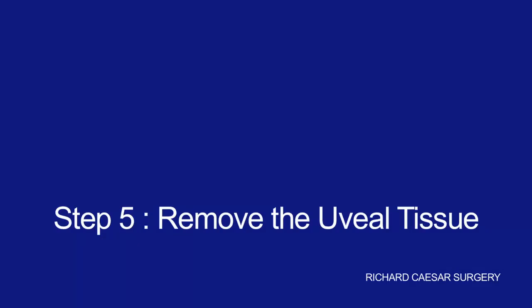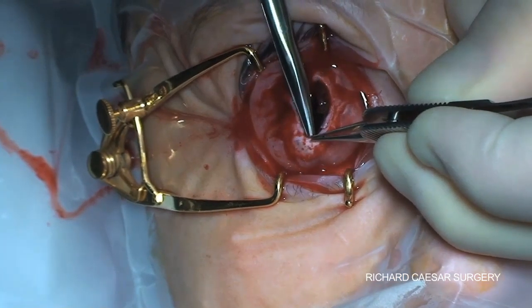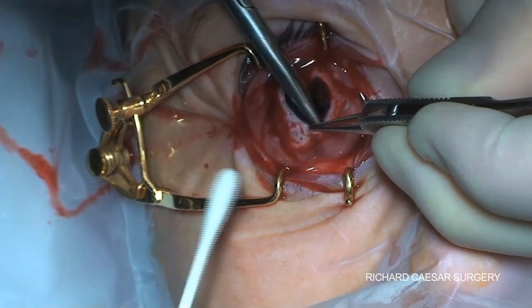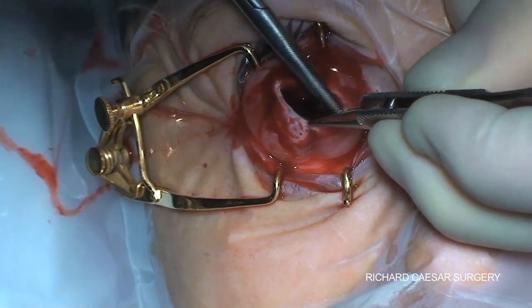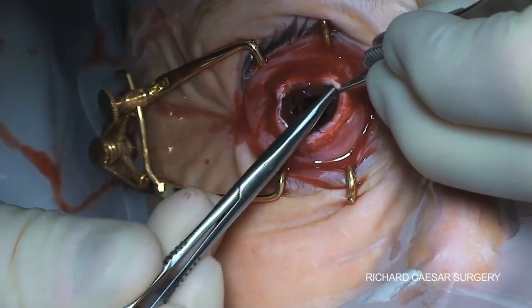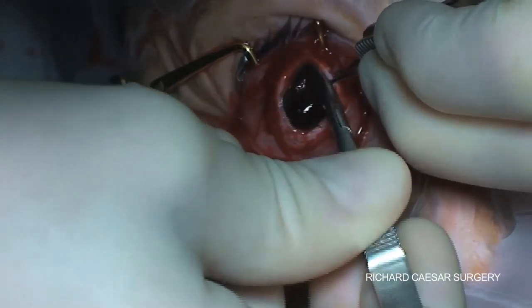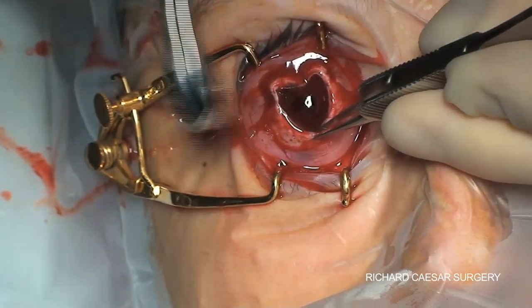All the uveal tissue needs to be removed to both minimise inflammation and minimise the risk of sympathetic ophthalmitis, which is thankfully very rare. I try and hold the edge of the sclera and use my spring scissors to open up the plane between the sclera and the uveal layer, as this makes the subsequent removal with the spoon a little easier.